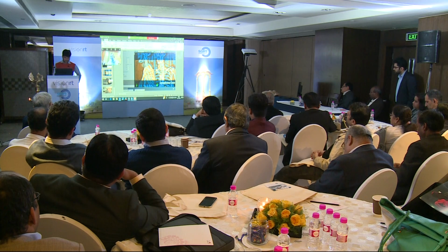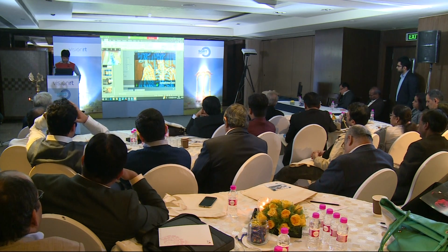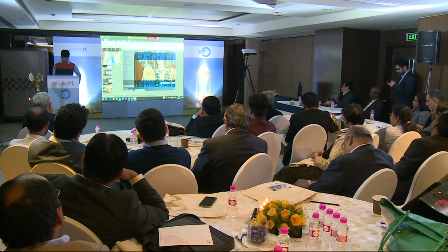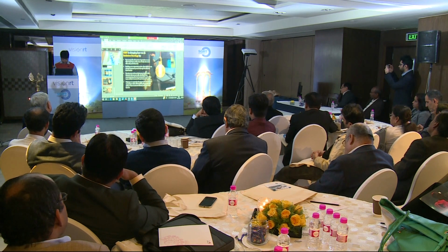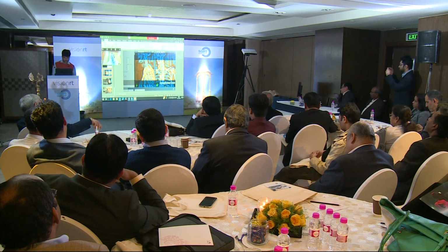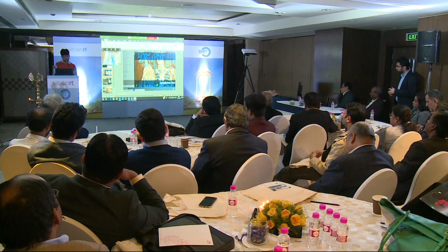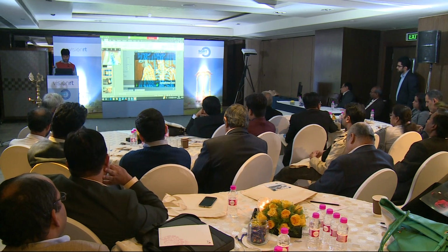And then you can also see, just as a matter of illustration, she had a frozen contralateral shoulder. If you look at the left lateral aspect of that right image on slide 31, you can see that the contralateral shoulder, due to the clavicular pitch displacement, is not in line, but it's also not in the treatment field. And so we're focusing mostly on the posture throughout the treatment field, and while the contralateral shoulder is frozen, we're not allowing that posture to affect the treatment area.